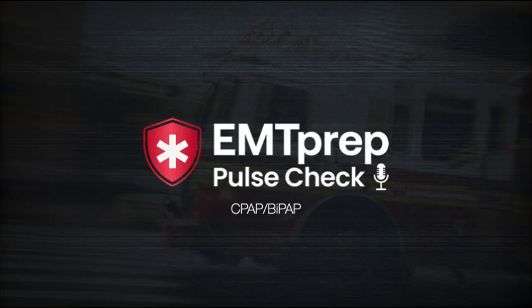This one should be pretty straightforward, but can trip you up due to some of the wording. We, of course, want to improve their ventilation and oxygenation efforts, and we know that this is non-invasive positive pressure ventilation. The key here is that the patient is already in respiratory distress if you're implementing CPAP or BiPAP. So we're not preventing respiratory distress, we're preventing a respiratory arrest, or at least we're trying to.